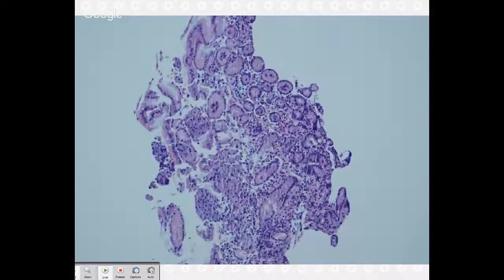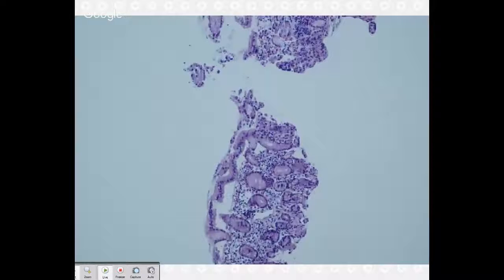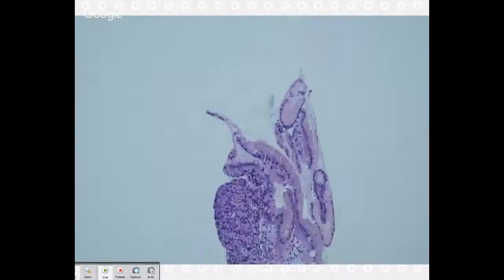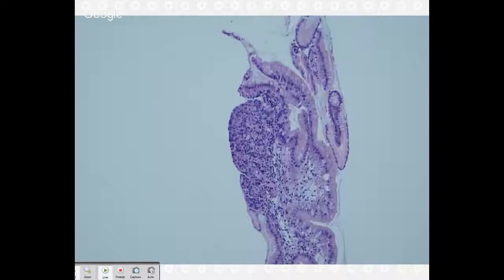The lamina propria just has too much stuff in it. Squished, toothpaste, oxyntic, it's been squished out here. Squishosis is my favorite term for that. And then you get down here, and you're like, whoa, wait, that's not all lymphocytes anymore.